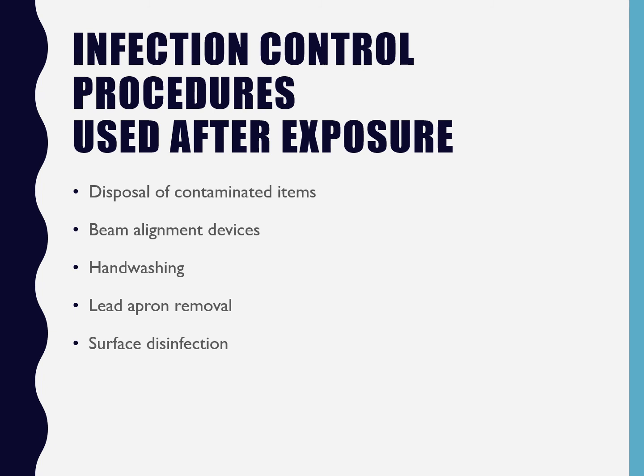I'm sorry. So first, you finish taking your radiographs, you're good. You would then take your gloves off, you'd wash your hands, you'd go in the room, you'll take the lead apron off of your patient, you'll hang it up, you'll put the thyroid collar just like I told you, and then you're going to walk your patient back to your operatory. I do not recommend telling your patient where to go and hoping that they find it, because that will lead them into other people's operatories potentially, and you don't want that to happen. So walk your patient back to their operatory, and then you will come back to your radiology room. You'll have washed your hands before you walk them back, so your hands are still clean. Don't touch anything in between there.